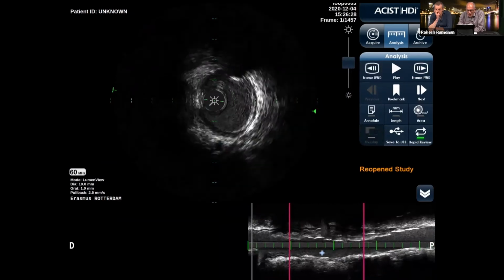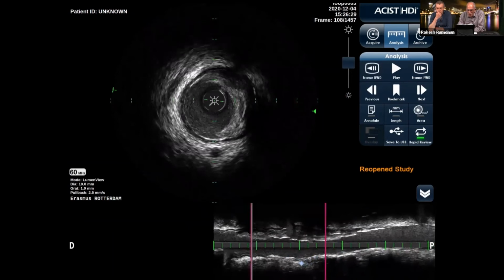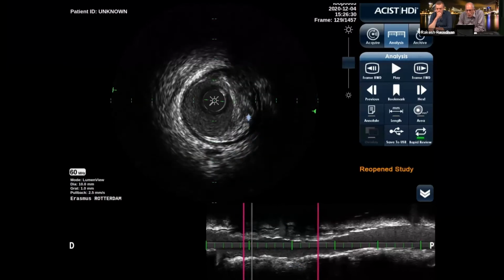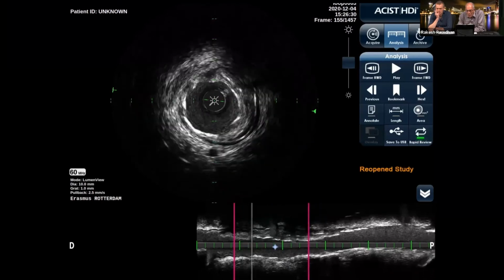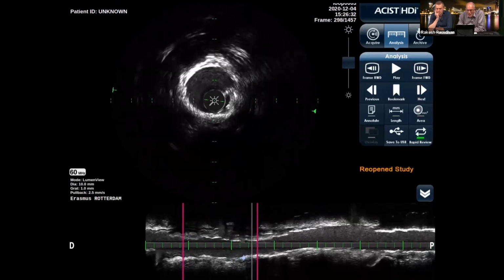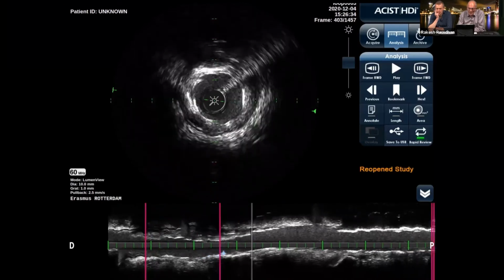And then if we go more proximal, there we have the stent struts. Let's quickly have a look if we already see an edge dissection. Yeah, maybe a very small one in here, but that is subintimal. It's not attaching the media. But let's see what happened, if he was in luck or not. Now, what we see is still a lot of plaque, but we have to measure behind the strut. Here is the calcium. Yeah, and also the site probably where the lumen is the smallest.